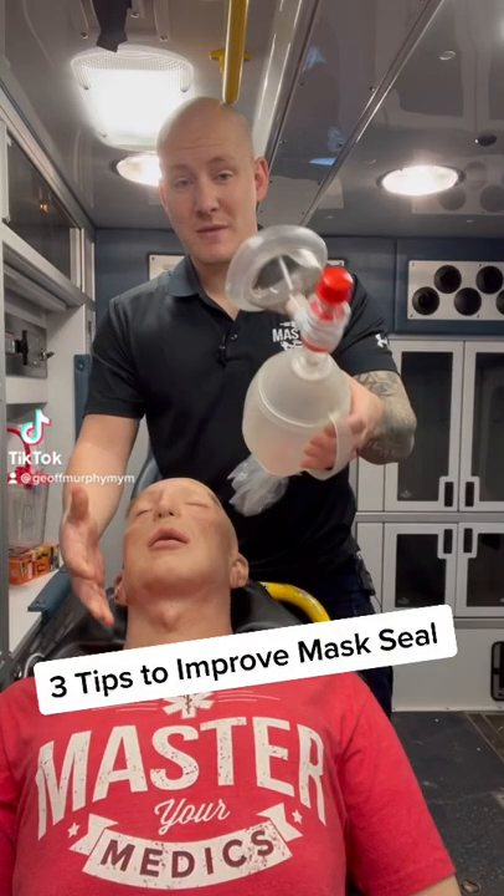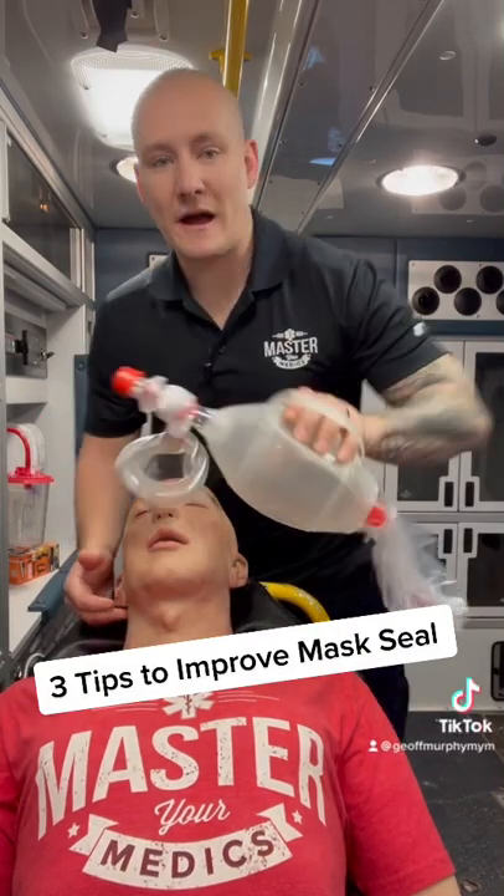Do you have trouble getting a seal with the BVM and the mask? Let me show you a couple tips that'll help with that. There are three parts to this. First off: positioning.